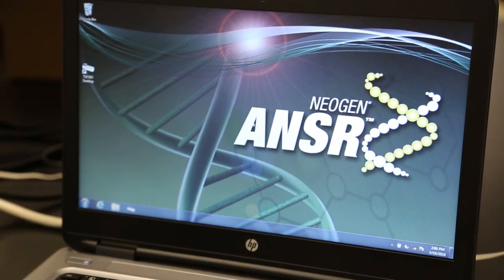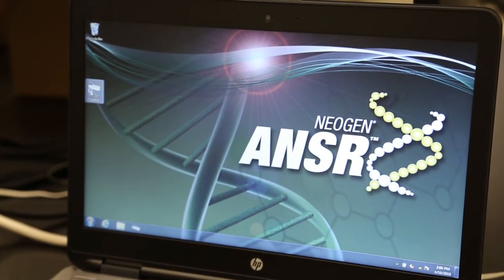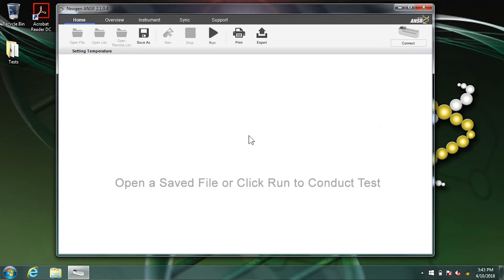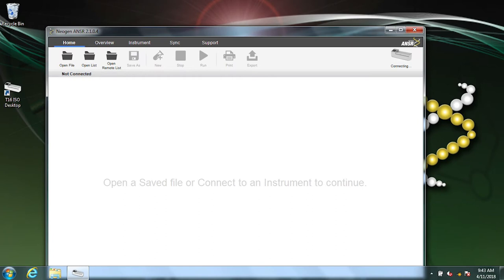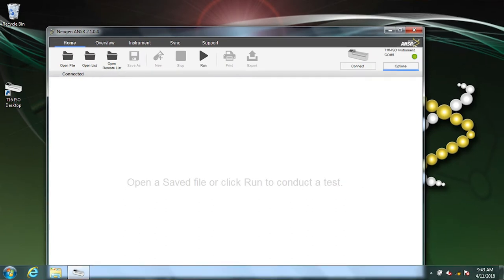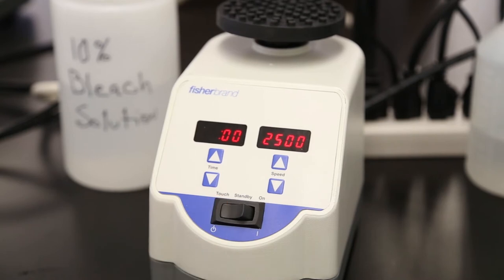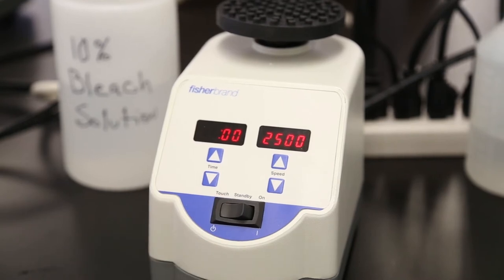Turn on the laptop and double-click the T16 ISO desktop icon. In the upper right-hand corner, click Connect. A dialog box will appear. Click Connect next to one instrument available. It takes a moment for the computer and reader to connect. When they do, a new menu appears, as well as a green light in the upper right corner of the screen. Now, make sure that the vortex is plugged in and turned on.